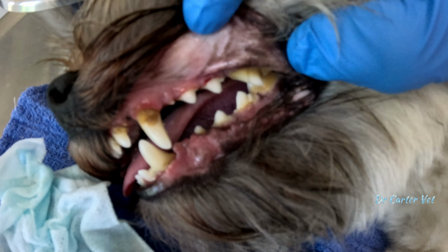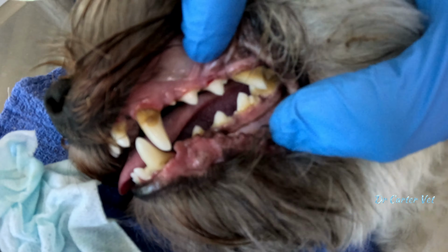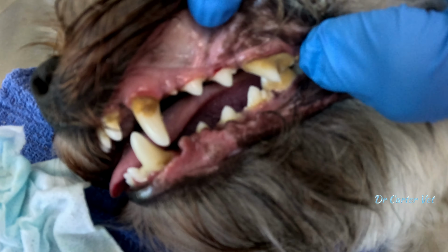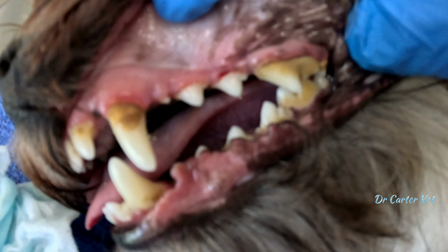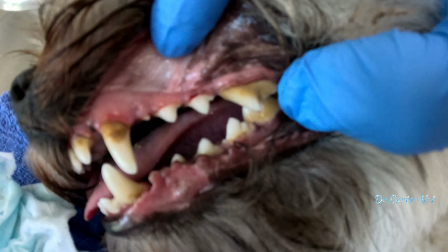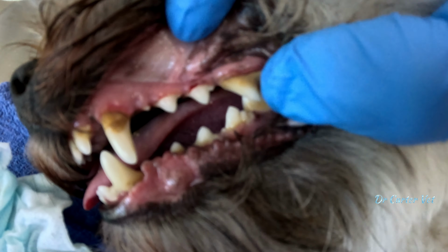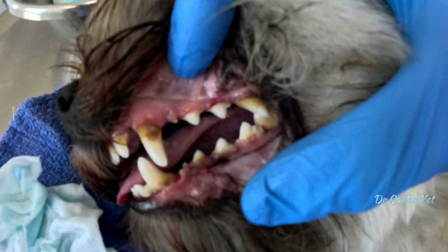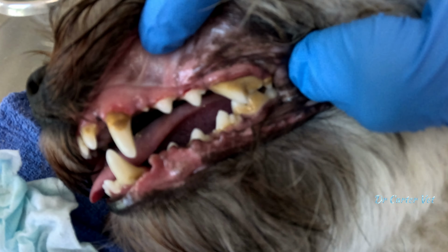Today I wanted to give you a behind the scenes look at doing a dental cleaning on a dog. I also want to tell you why it's important to have your dog's teeth clean. Just for comparison, those two teeth here, I've already cleaned them. If you compare them to those on the side here, you'll notice there's a lot of tartar on this, but on the other side, they're pretty white. So just hold on one second, let me clean this out and show you. It makes a big difference to the health of the teeth.